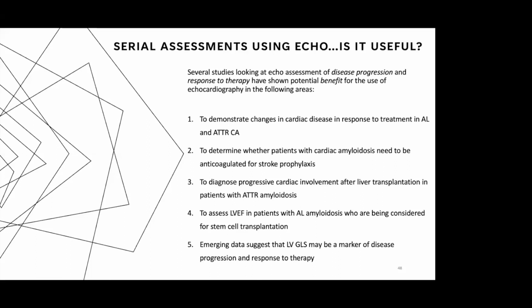So when looking at serial assessments using echo, is this actually useful? There are several studies that have looked at echo in assessing disease progression and response to therapy, and they show that echo is actually quite beneficial. In one circumstance, it can demonstrate changes in cardiac disease in response to treatment in AL and ATTR-CA.